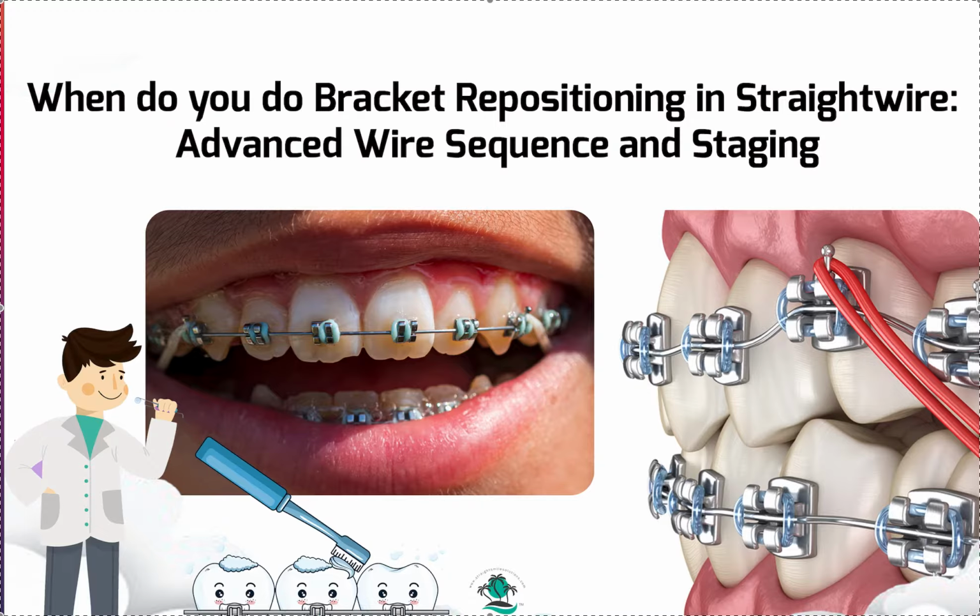Oh, I don't think these are right. When is the right time to move things around? Well, in general, if I see something that's just egregious, like obviously wrong, like it totally slid, I'm going to fix that as soon as I see it.